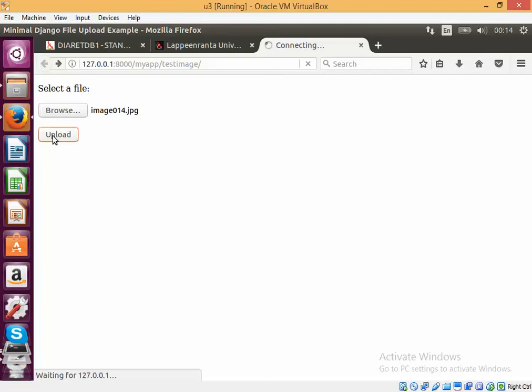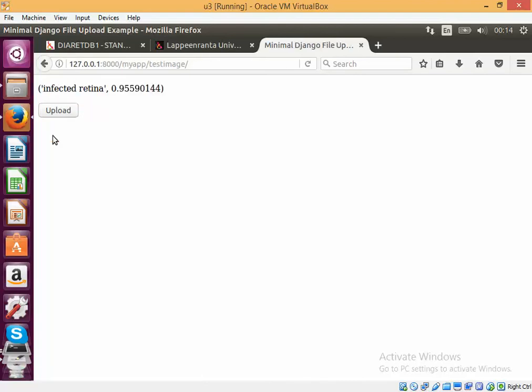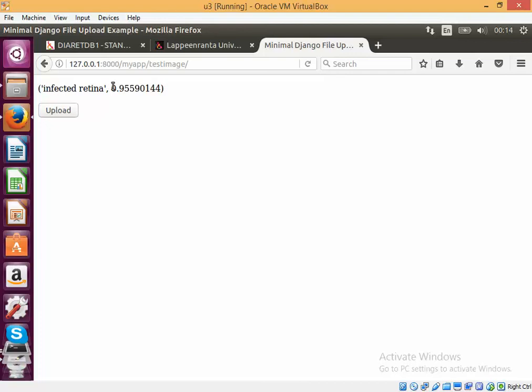Okay, you can see that the performance is quite slow because I am using a CPU. Now in the case of a real, okay, now it is showing that it is an infected. So it is able to classify an infected and a normal retina successfully, which is quite good, which shows the robustness of the TensorFlow model.